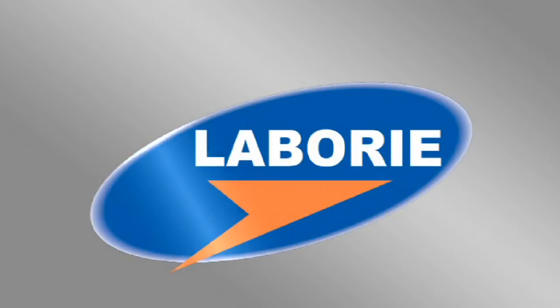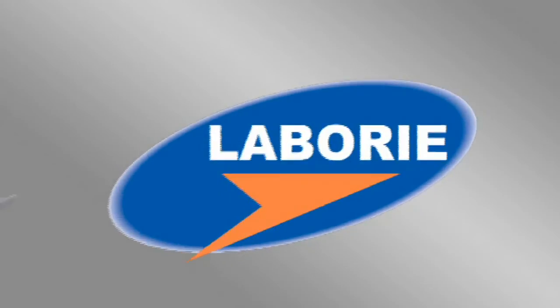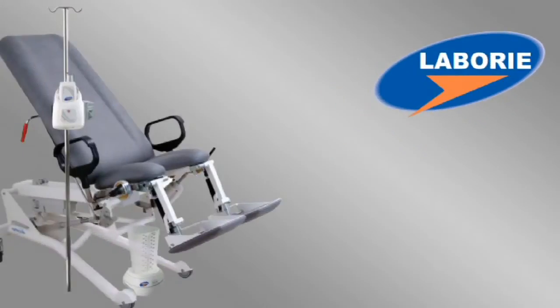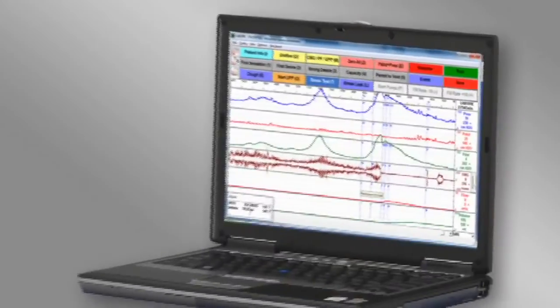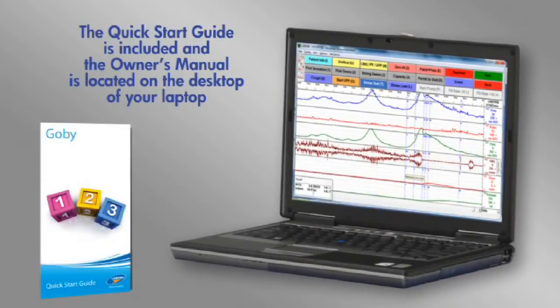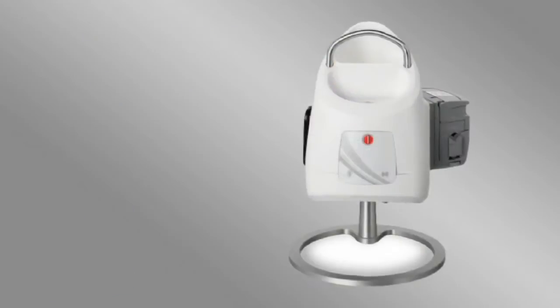Congratulations on your purchase of the Gobi wireless Eurodynamic system. This video is a helpful overview of how to use this innovative system. Your system comes with a quick start guide, and you'll also find a copy of the owner's manual on the desktop of the laptop.